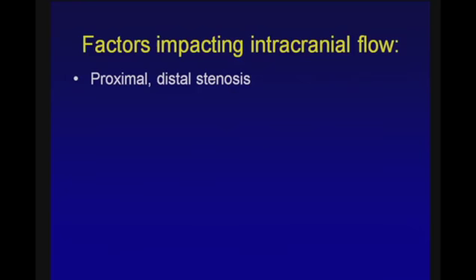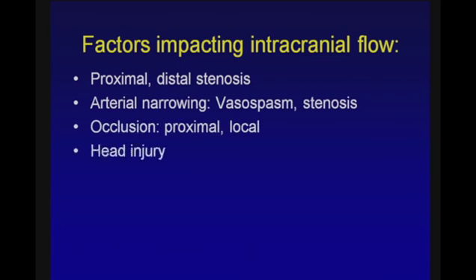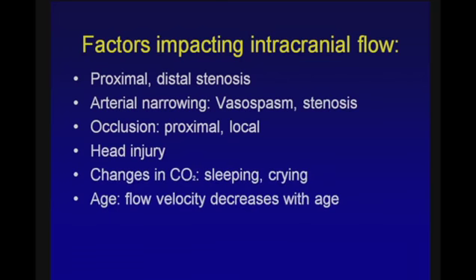Factors that impact intracranial flow include stenoses, vasospasm, complete occlusion, head injury with increased intracranial pressure, changes in CO2, including simply crying or sleeping, and as I mentioned, age, where flow velocities can decrease with age and your resistive indices can change.